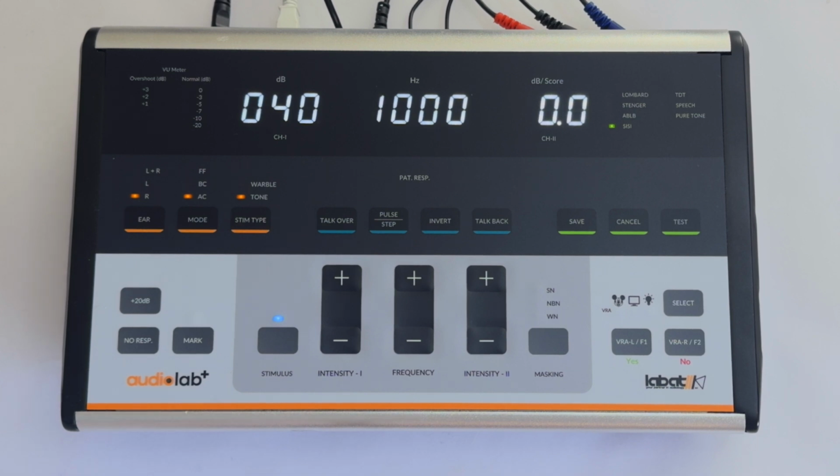The patient will hear a continuous tone with small increase in loudness. Ask the patient to press the response switch whenever they notice even a slight change in the sound. As the patient responds, the score will automatically be shown on the Channel 2 display. The clinician can make number of observations as per his or her diagnostic requirements.